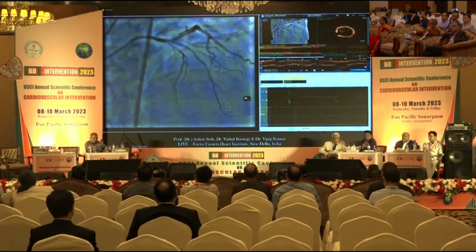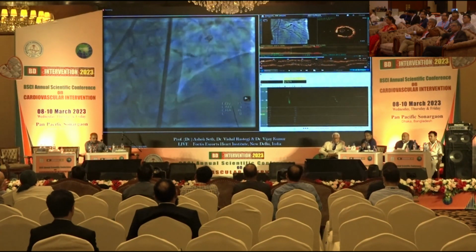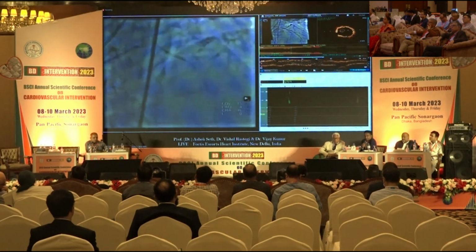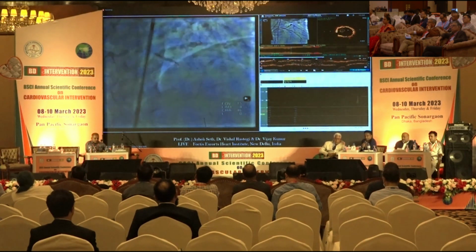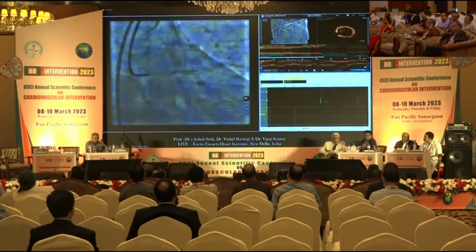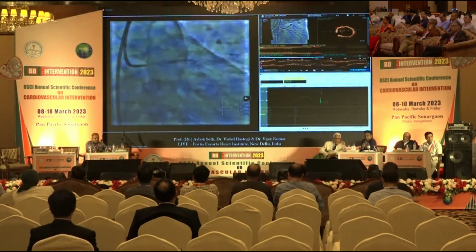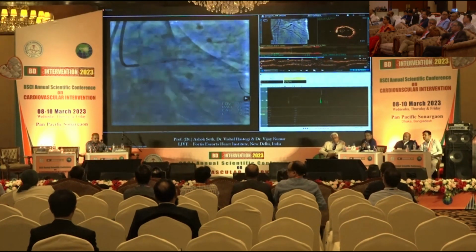And so I took you to the IVL, and this is where we left you. Yes, 80 pulses were delivered here, as you can see. This is highly constricted. After the first 20 pulses, it partially opened up. The patient was getting very ischemic at this stage because it wasn't opening up, and he did have VT, but luckily his hemodynamics were okay. And so we continued on till we actually opened the lesion.